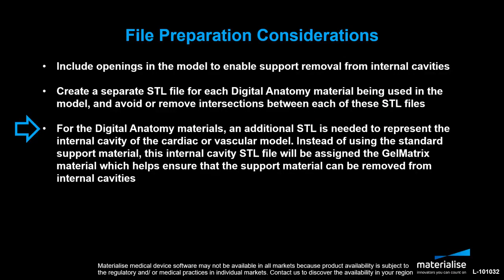In summary, we have demonstrated how an internal cavity STL file can be generated using materialized 3-matic so that cardiac or vascular models can be 3D printed using the PolyJet digital anatomy materials. Thanks for listening.